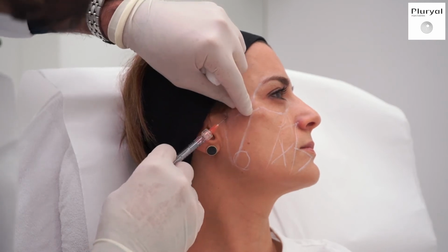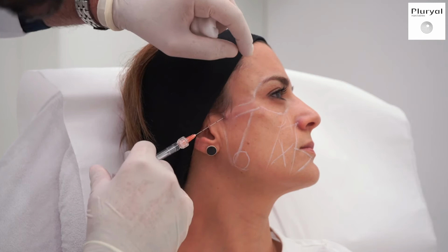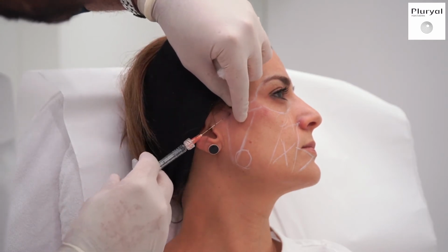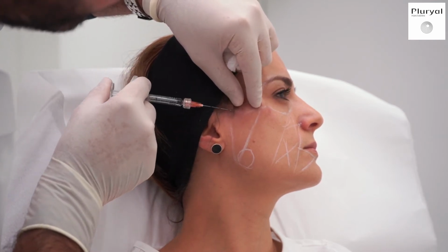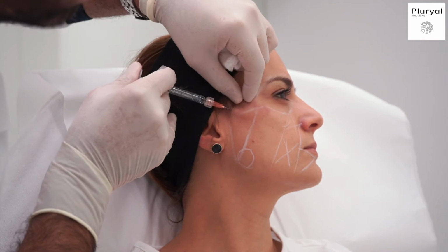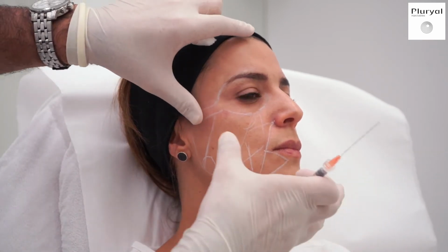And you have also to blend the temporal area. So I used here 1 milliliter.